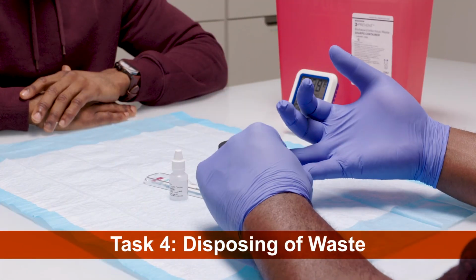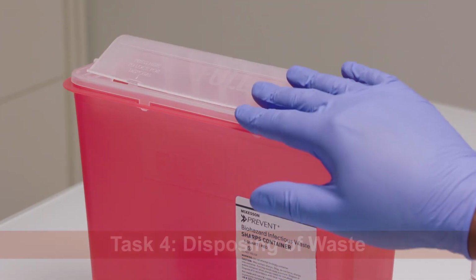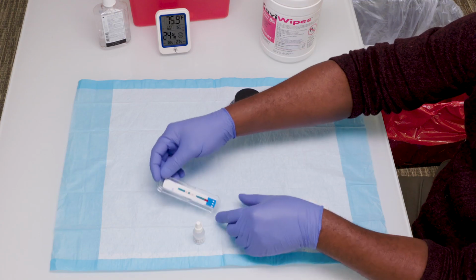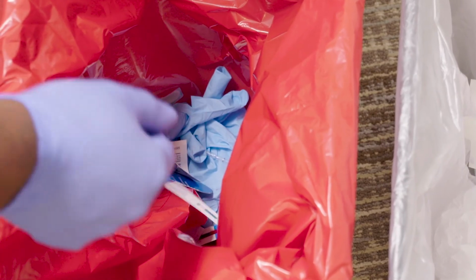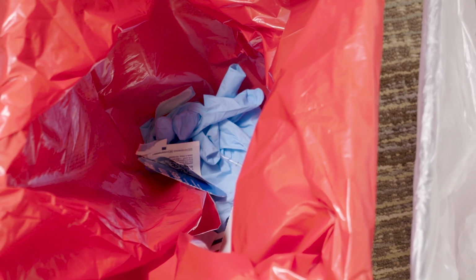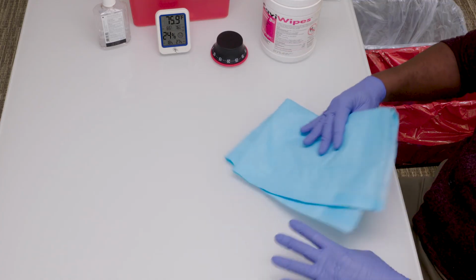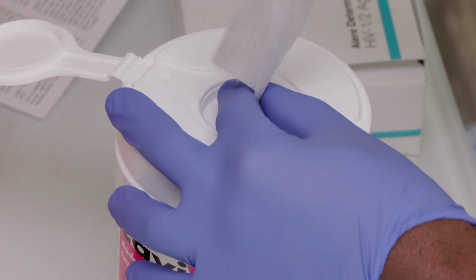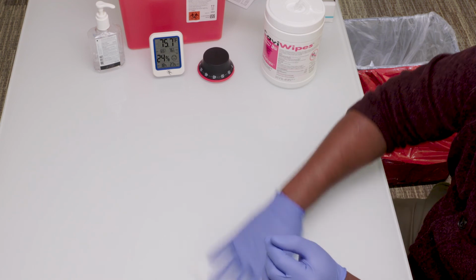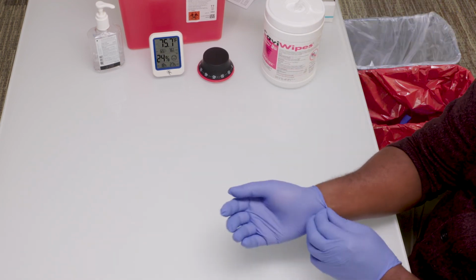After you discuss test results with the client, dispose of the single-use materials in the appropriate waste containers. Discard the test strip, workstation, gloves, used alcohol swab, and used cotton gauze in the biohazard bag. Place the packaging for the bandage and other materials that have not come in contact with any bodily fluids in the trash bin. If there are any spills, clean up with a 10% bleach solution.